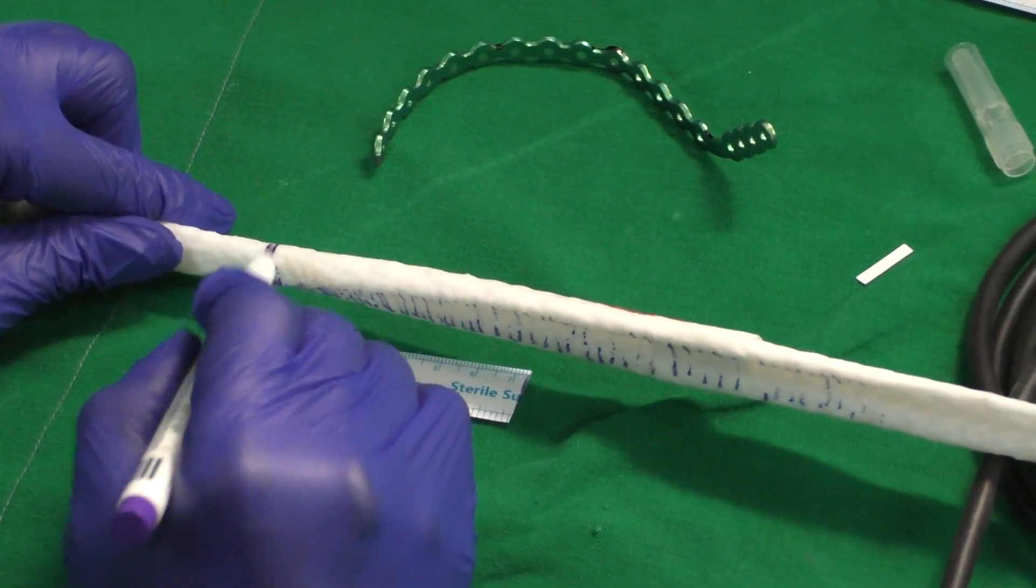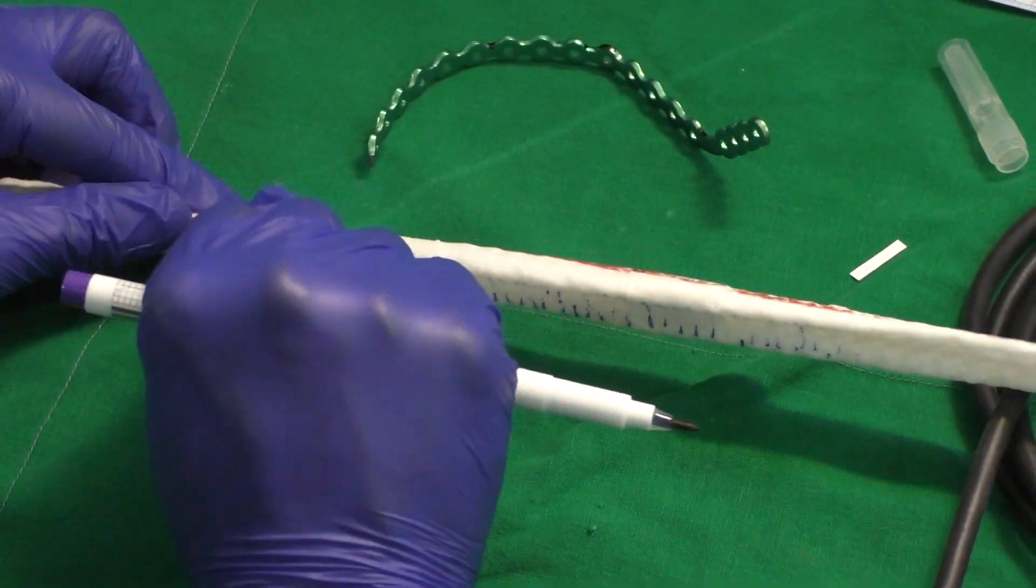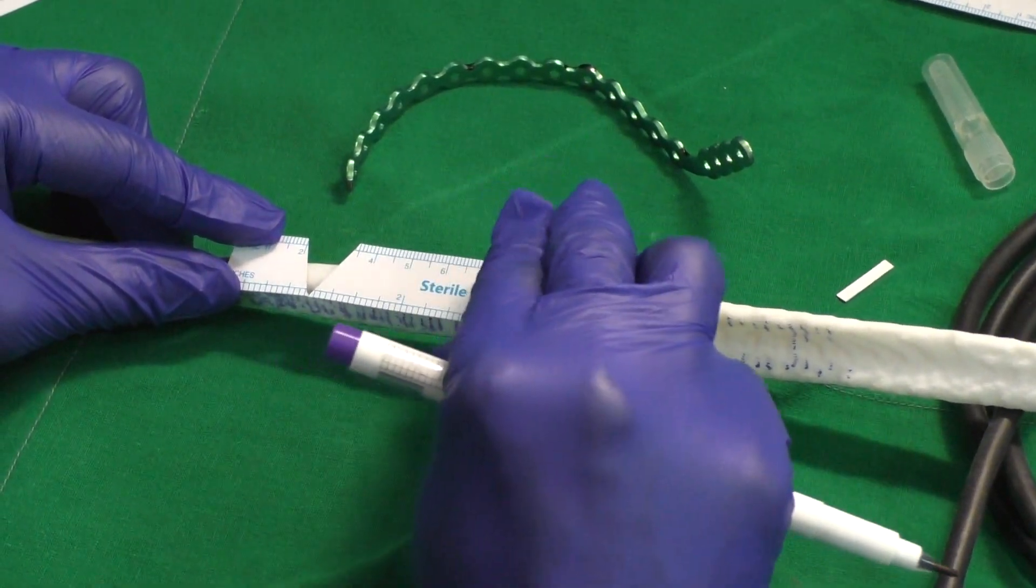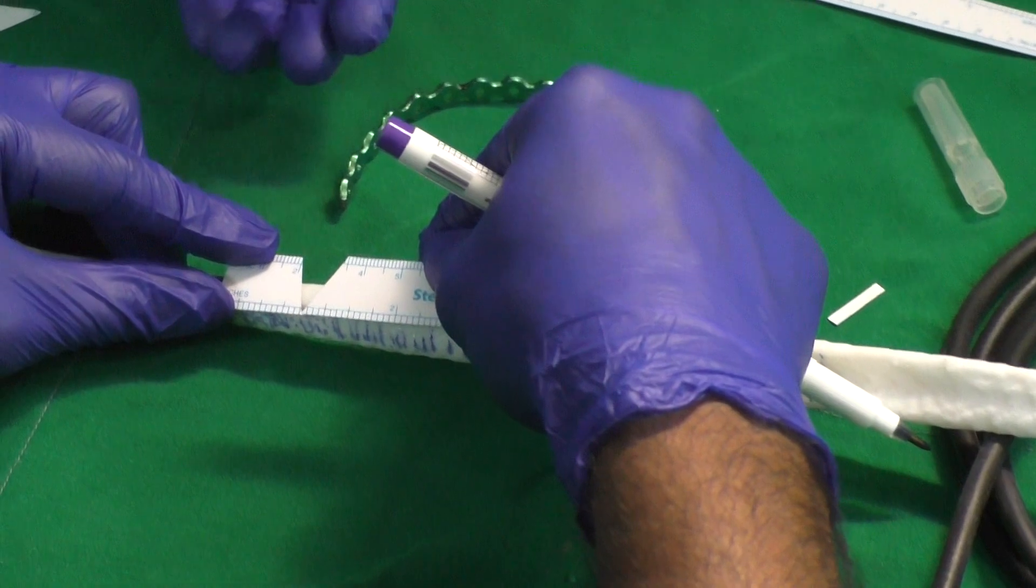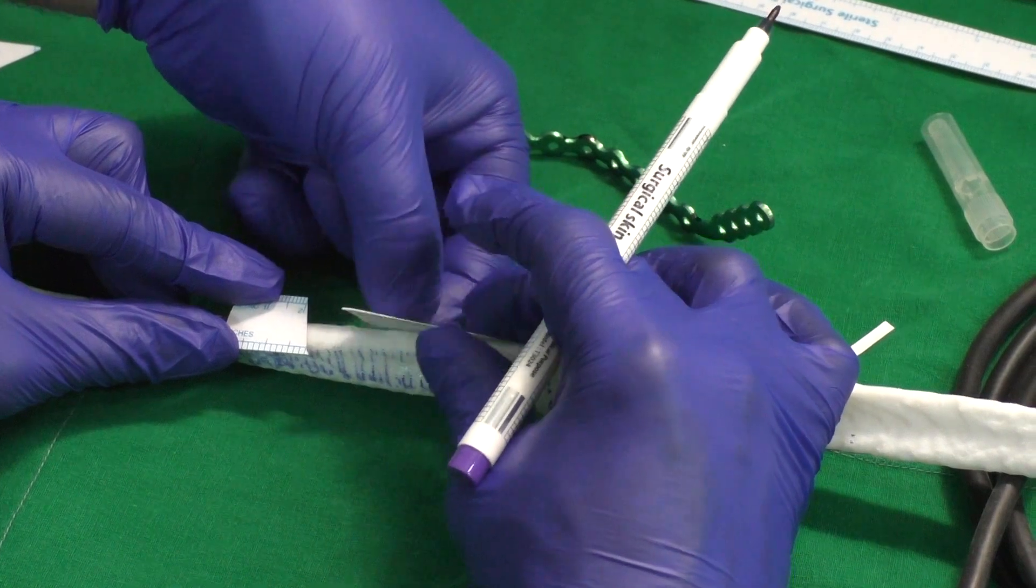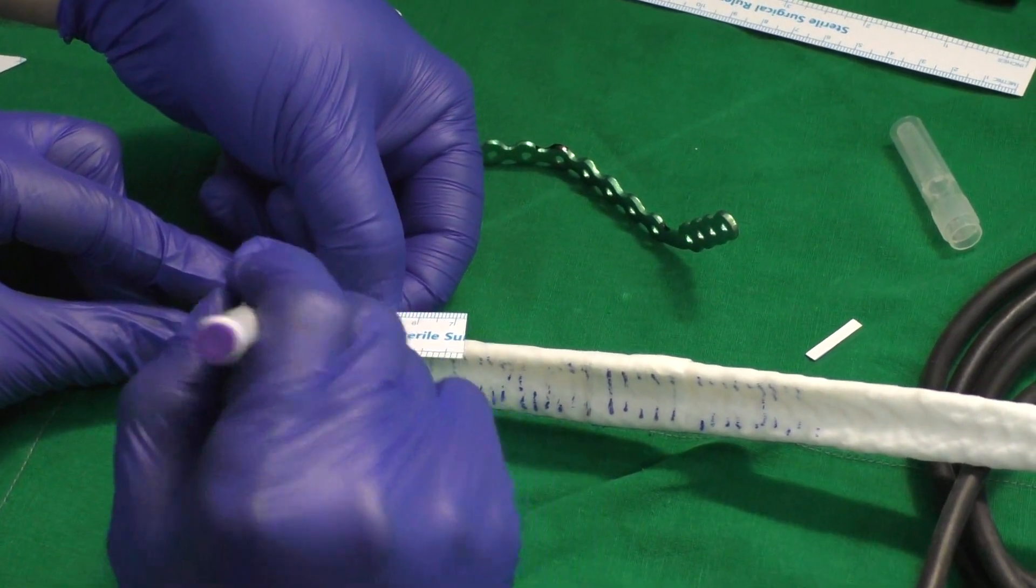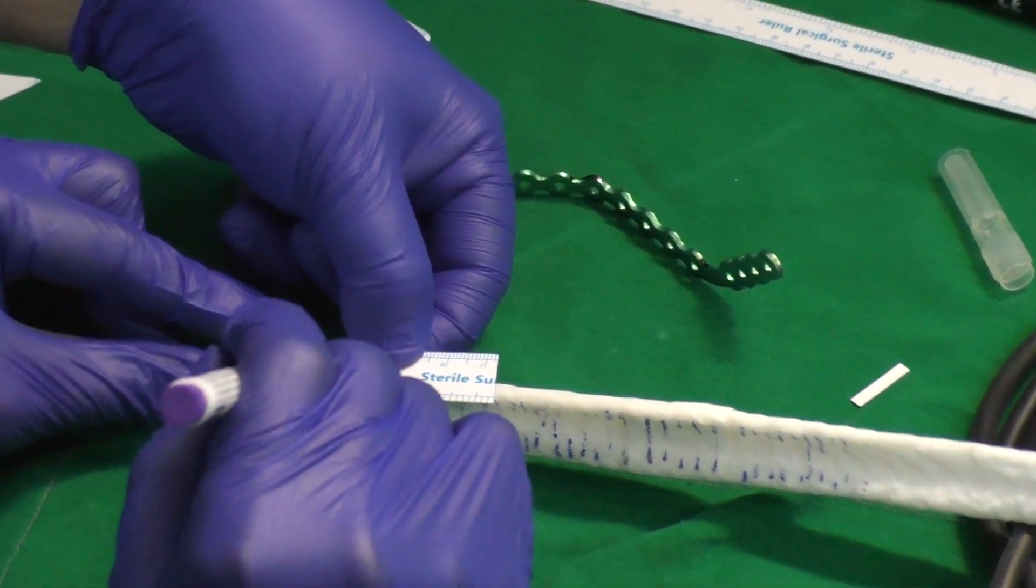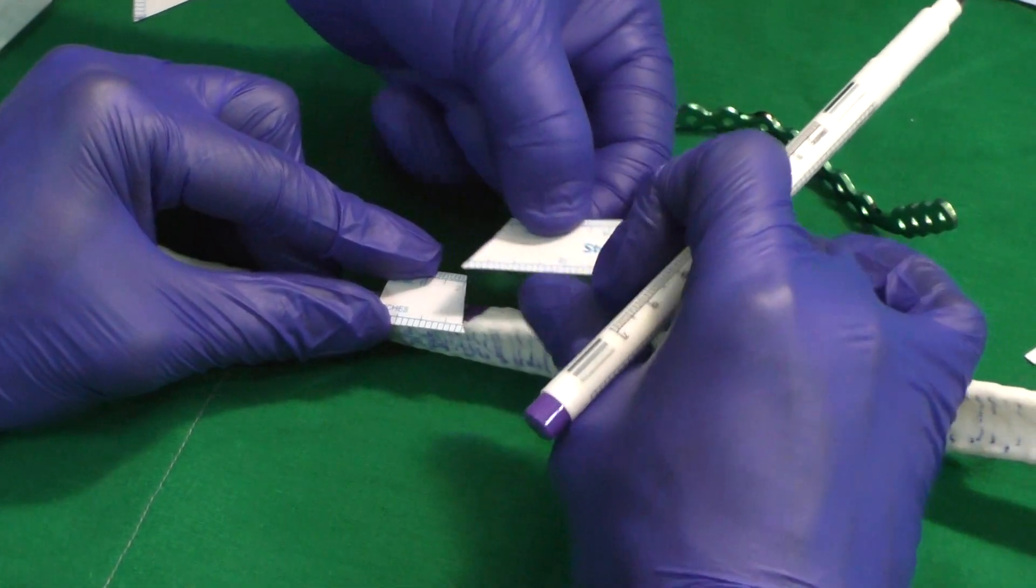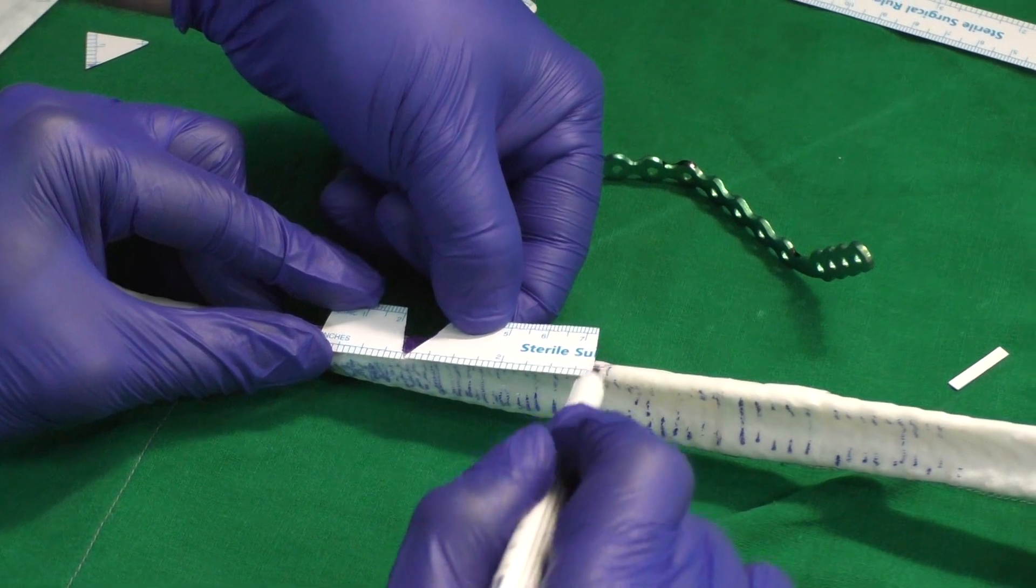The distal cut is marked all around the bone, and then because the osteotomy has to have the base on the inferior surface, we flip the paper fragments. It requires some time to keep it held in place, and then the wedge osteotomy that is required is marked on the inferior border. Always remember that the direction of the base is marked correctly. If you invert the direction of the base, the osteotomy segments will go outwards rather than inwards.